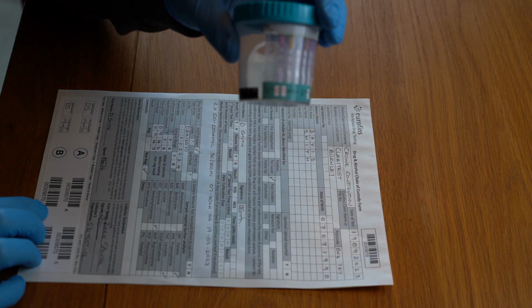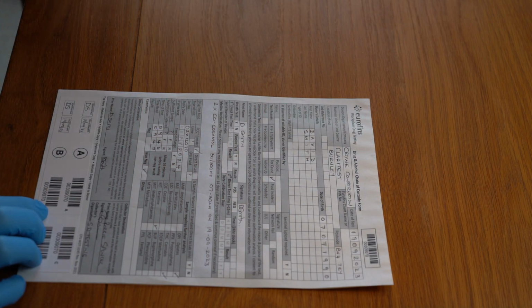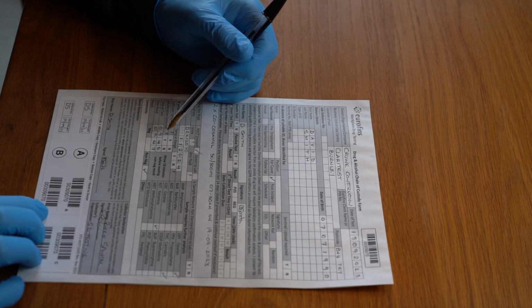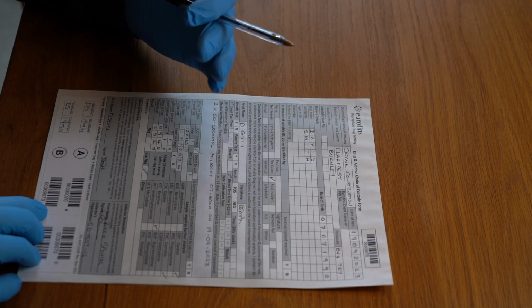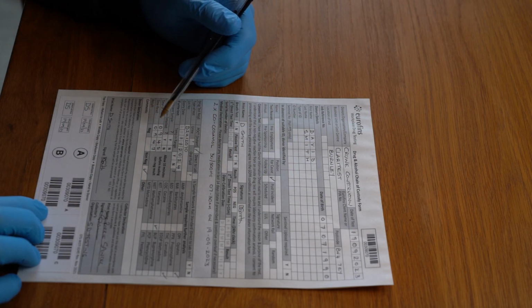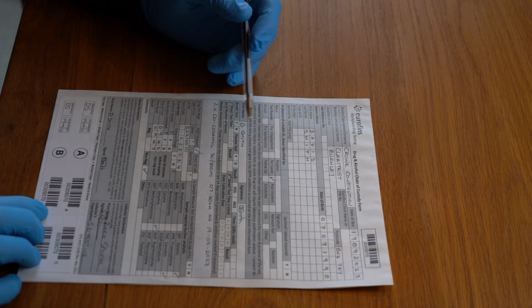Was there sufficient sample, i.e. did the donor urinate up to the minimum fill volume line? And did you detect any adulteration? Was the sample cold? Did it look like water? Was it a different colour? Anything that suggested to you that the sample may have been adulterated. Time of test was 9:45, and because with these type of kits you can read the results straight away, I read the result at 9:47.